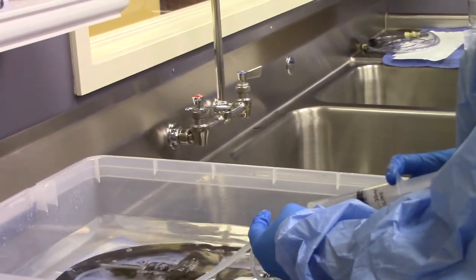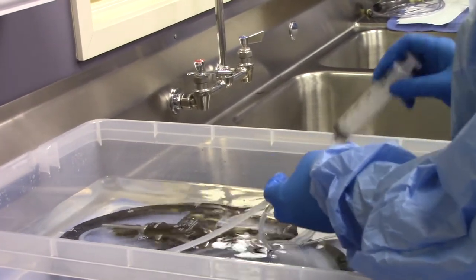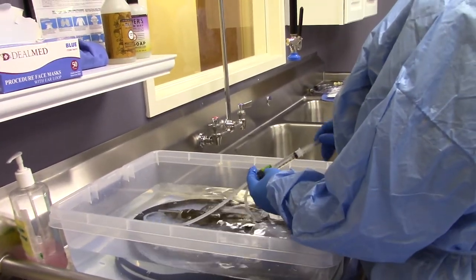This is the manual cleaning. If we are using the scope buddy, we skip this part. After the brushing part, we just put the scope into the machine.